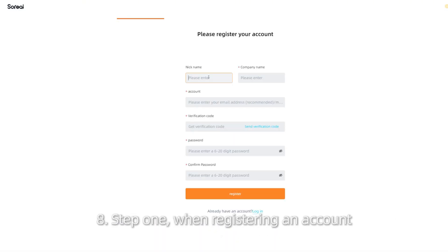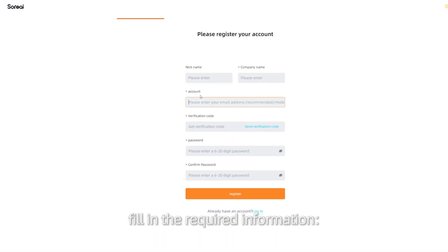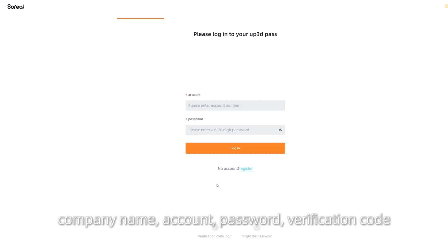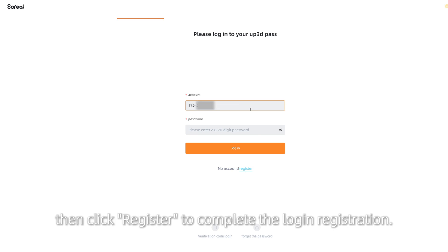When registering an account, fill in the required information: company name, account, password, and verification code. Then click Register to complete the login registration.